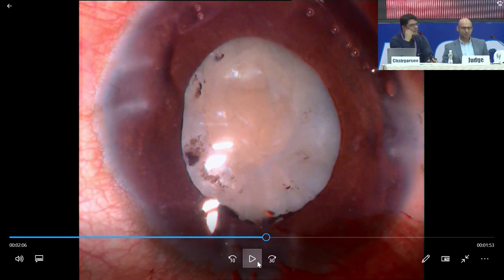So wherever you have very fibrotic capsules, which many times you are not able to puncture or cut through, it does that. That's a wonderful tool which we have. What do they call it? Yeah, that's an RF capsulotomy probe. Yeah, yeah, O3 has it. Yeah.